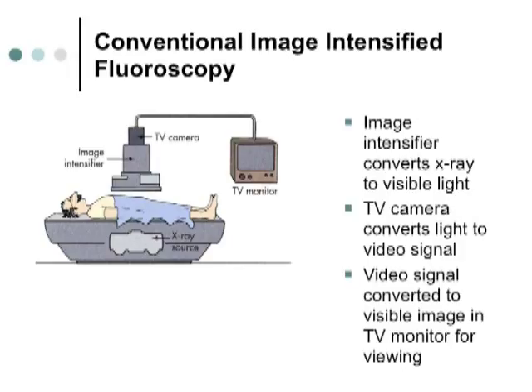Then we have the II tube, the image intensifier tube. That's also a vacuum tube that converts X-ray to light to electrons back to light again. Basically it's converting X-rays to light. That operates on 25,000 volts of current. And then we have the television pickup tube, or the television camera tube, and that operates on about 250 volts.